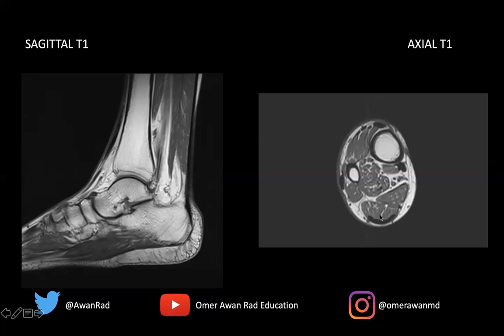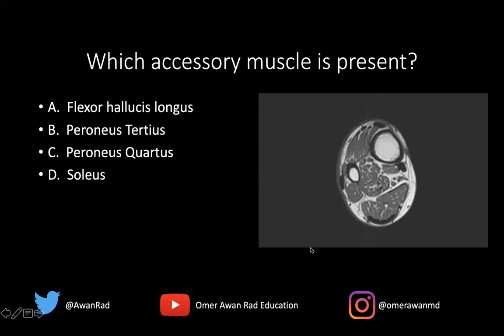On the axial image, we're very far inferior — past the tibiofibular syndesmosis and the interosseous membrane — and we still see a very prominent soleus muscle. So this is an accessory soleus muscle.